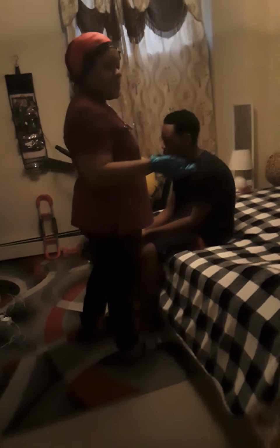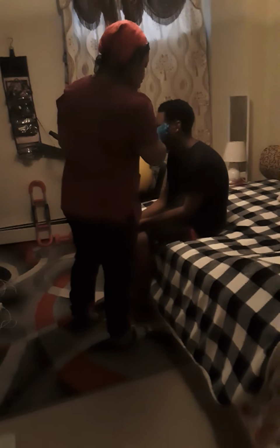So we're going to inspect the tympanic membrane. On examination, the external ear canal is brown in color with no discharge or foreign bodies. I'm going to pull the ear up and back because he's an adult. The tympanic membrane is gray in color with no bulging.